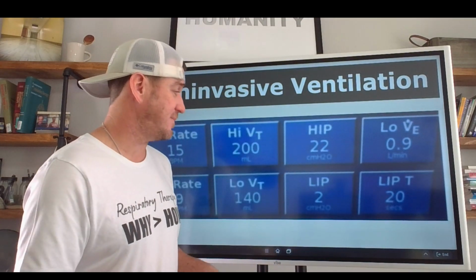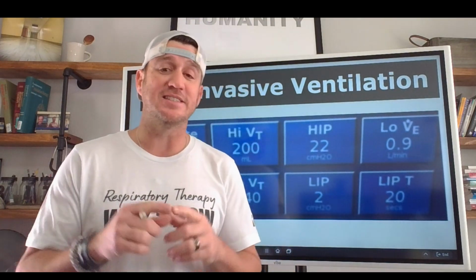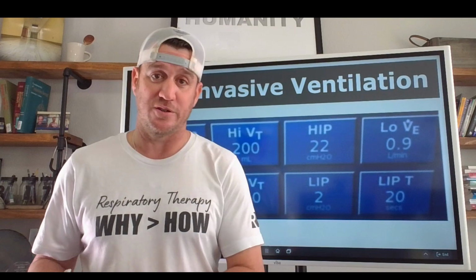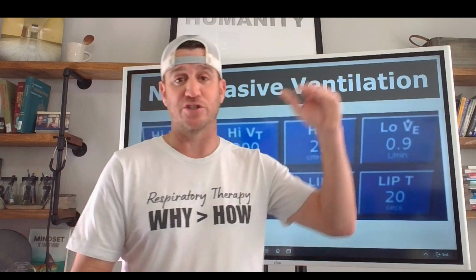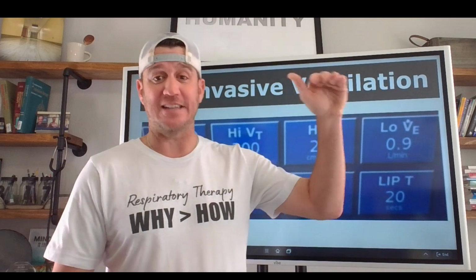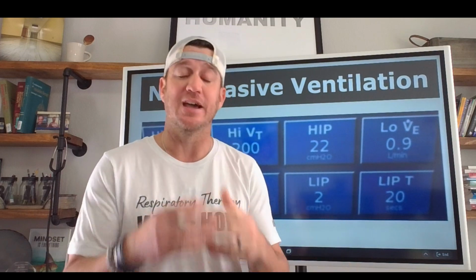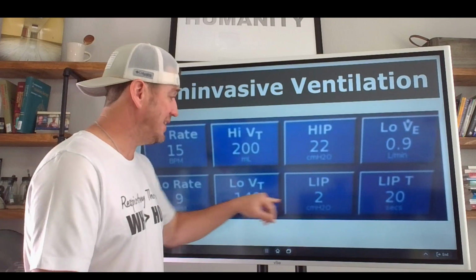and we want to know when that's happening. Now, as far as the low inspiratory pressure goes, this one is kind of tricky because this is an inspiratory pressure. So remember, if I told you that during the inspiratory phase we're raising the pressure to 15, but it only actually gets to 8, then did it get to 15? No, it did not. Why did it not get to 15? Likely there's a leak in the system.